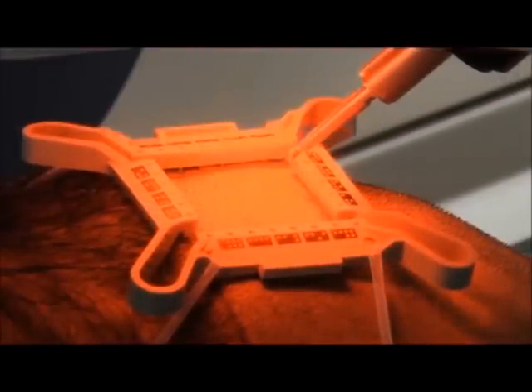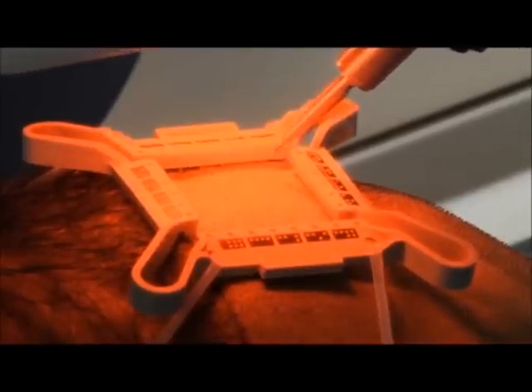We've programmed the robot to avoid the single-hair follicle units — it's going for all the two- and three-hair follicle units. The reason we do that is because it minimizes the number of holes for the amount of hair we want. By avoiding the one-hair units, we can use all the two- and three-hair grafts for the transplant.